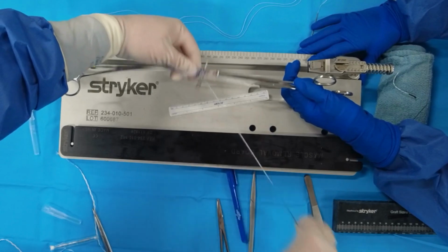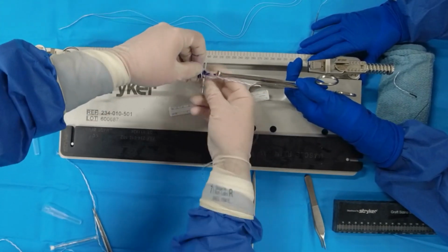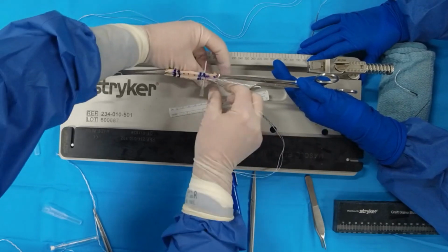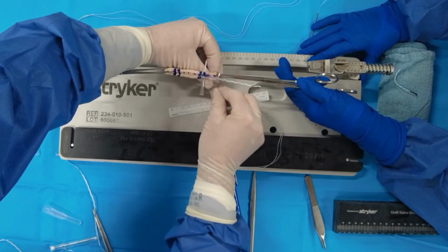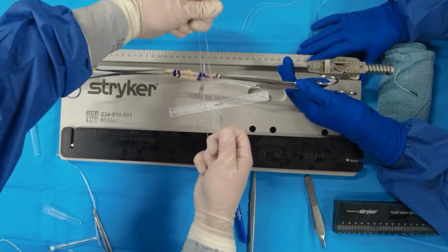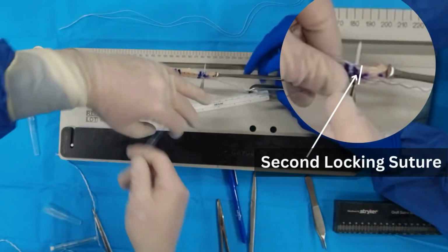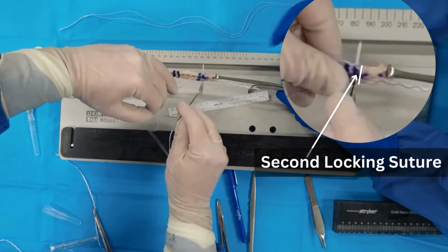And then I'm going to jump across to the other side again, on the other side of the angiocath, and we're going to do the same thing and just do a simple locking suture on the other side as well, just right behind that prior placed pass. We're going to put this through and tension it. And once you put that, you're done.